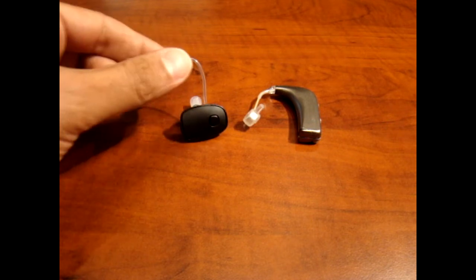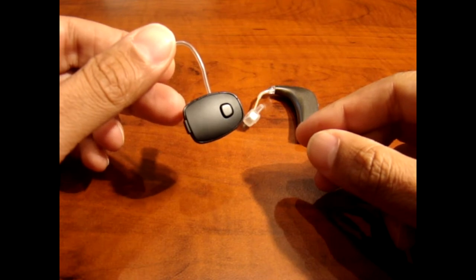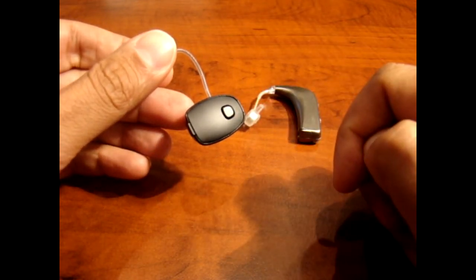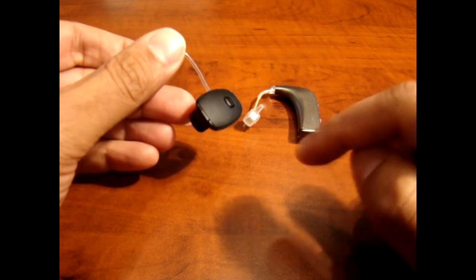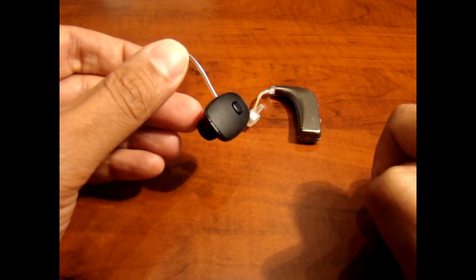With the CS device, when you receive a phone call, to answer the phone call, just tap the volume button and that will answer the call. Then when you're done, to end the call, tap the environment mode button on the back and that will end the call.